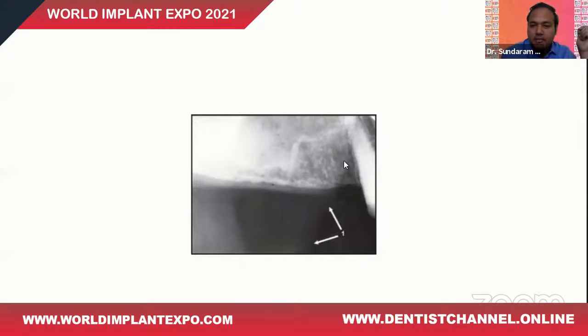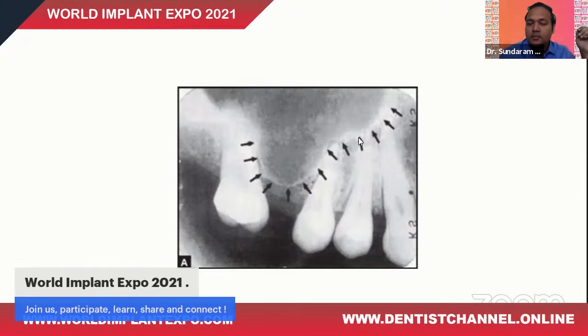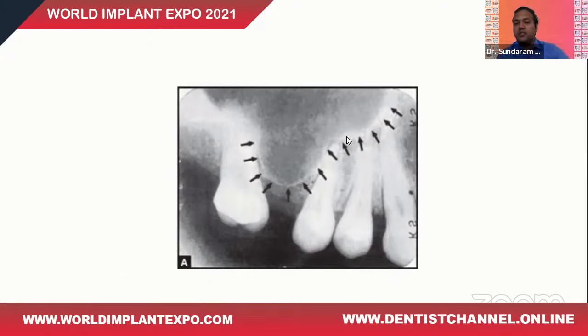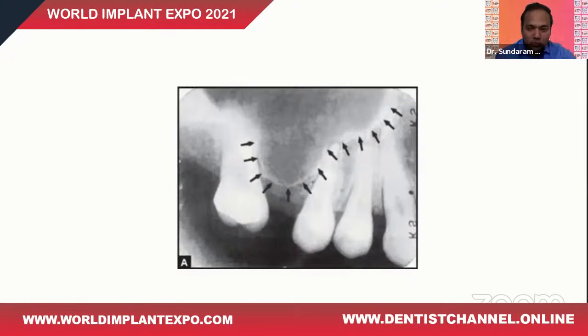This is the radiograph of upper posteriors, edentulous region. And this thin line of shadow is nothing but the nasolabial fold that you can see running across it. Whenever a maxillary tooth that is in close approximation with the maxillary sinus has been extracted, it is very common to see after some time that the maxillary sinus dips down. This natural phenomenon is known as pneumatization of the maxillary sinus. And the reason why it happens, we do not know.